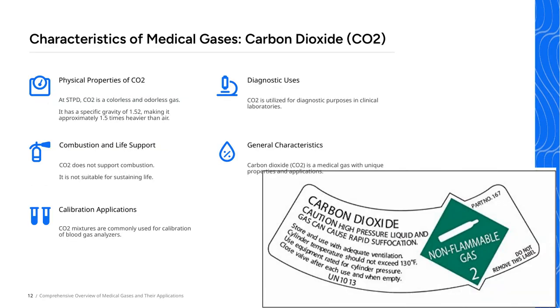Now, let's take a closer look at carbon dioxide, or CO2, as a medical gas. It has some unique properties that make it particularly useful in healthcare settings. For example, CO2 is often used in diagnostic procedures within clinical laboratories. It's commonly employed for calibrating blood gas analyzers, ensuring that test results are accurate and reliable.